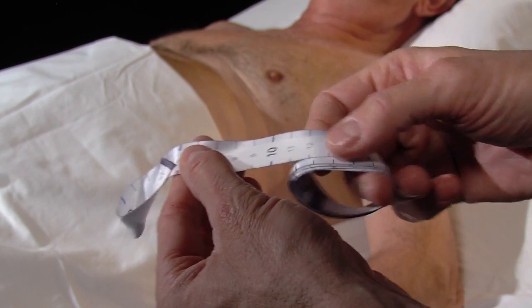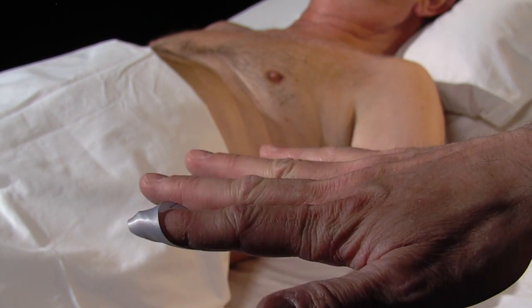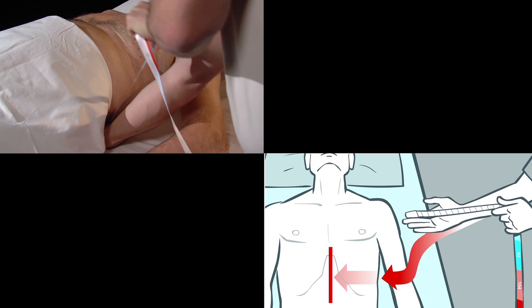Uncoil the measuring tape and insert your index finger into the loop at one of its ends. Tighten the tape slightly with the other hand. Now slide the hand bearing the loop under the patient's back until you clearly feel the spine at the tip of your index finger.